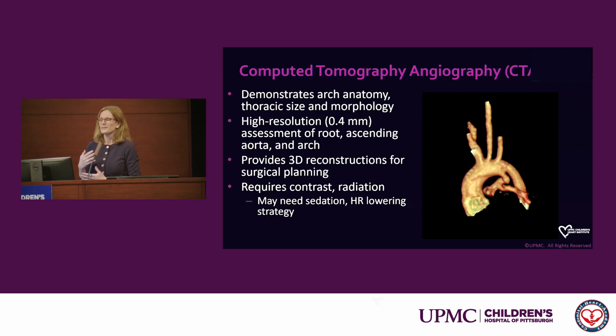The radiation exposure and the anesthesia and sedation route for that kind of imaging is totally different than a newer generation scanner or photon counting scanner, where those images happen so quickly that you can really minimize cardiac motion, even without gating, but I would always recommend gating. You can get a still shot of the root. My colleagues here, Adam and David, are doing this at a radiation dose that approximates a chest X-ray.